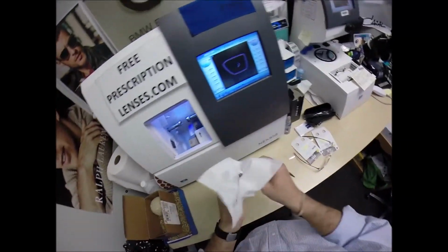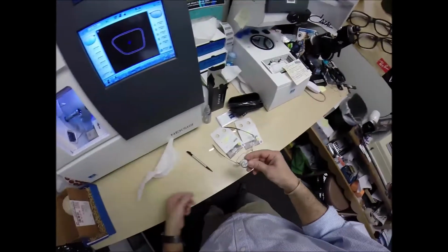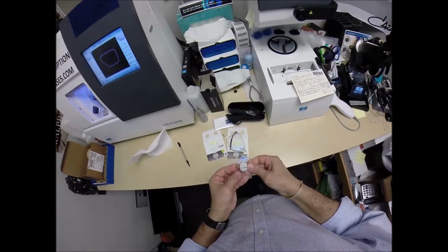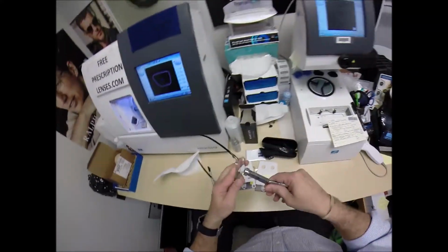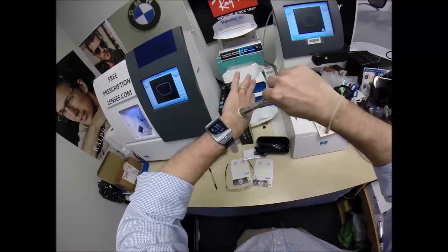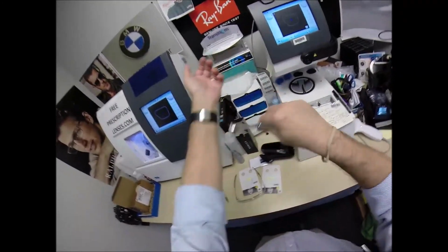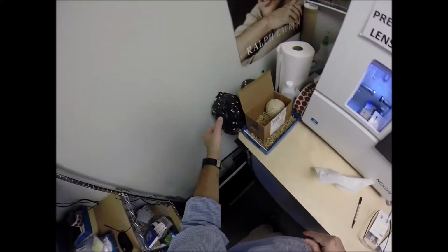Take the lens out of the chuck. Tuck that in at the outside corner, press down at the nose, it snaps right in. Pull the block away, use my hand-approved drying method, back of the hand, little bit of forearm drying action there. Yeah, good, just rub stuff all over my body during the scare.